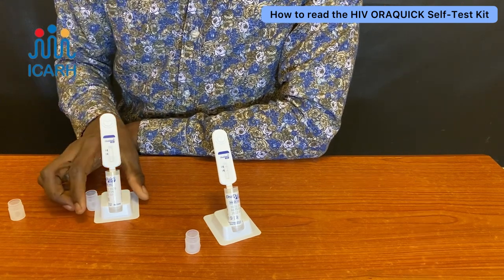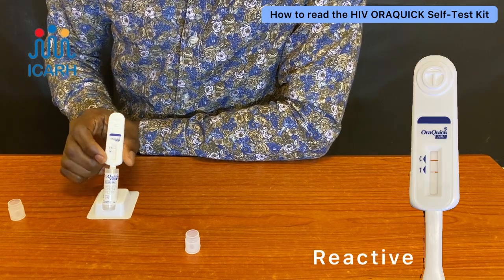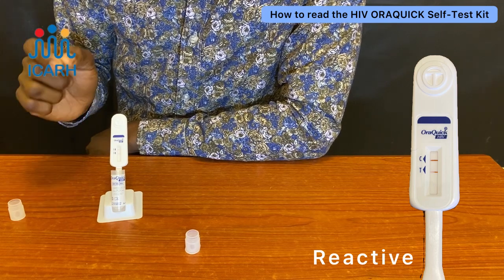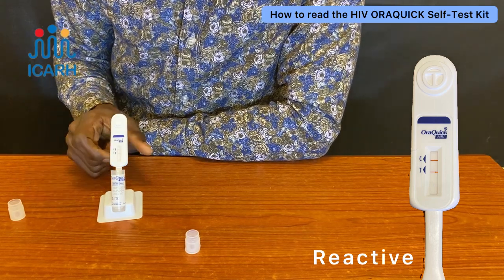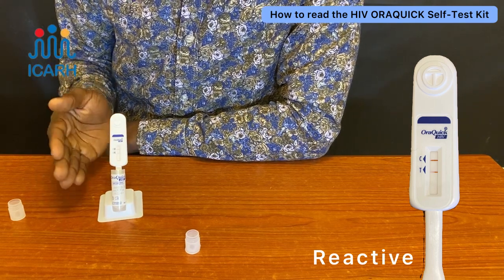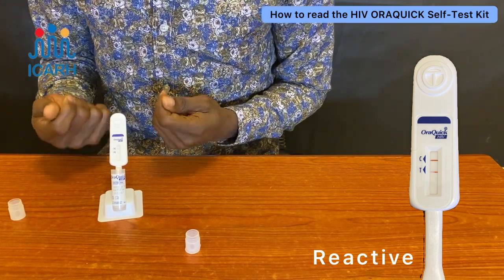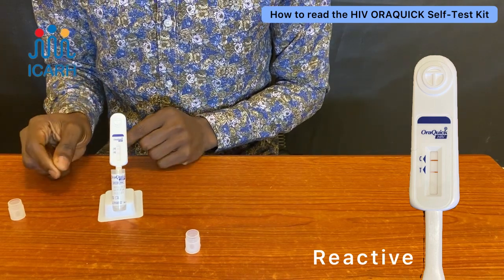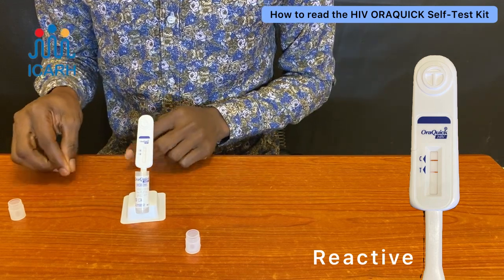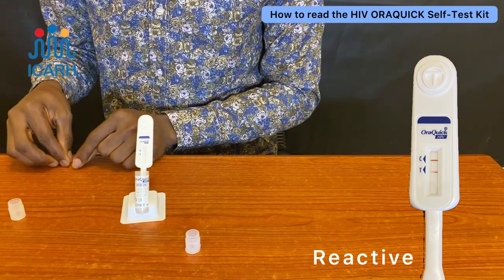For a reactive result, you can see two lines — one on the control side and one on the test side. We don't call it positive because this result is sensitive but not specific; it can pick up any infection you might have at the time. To confirm an HIV result, you need to do a confirmation test with a more specific test kit.